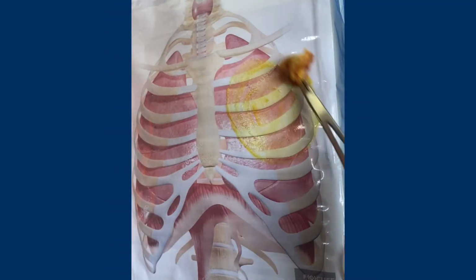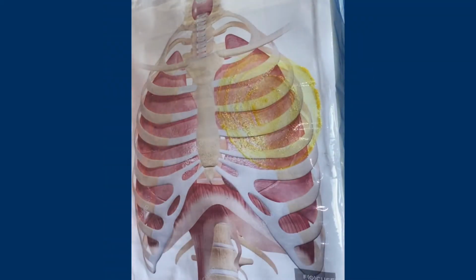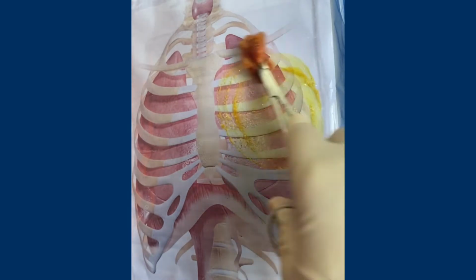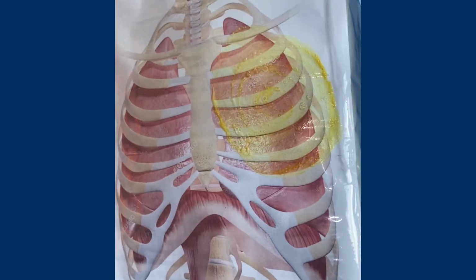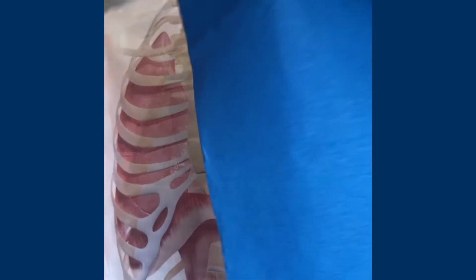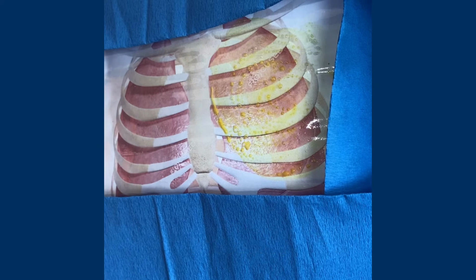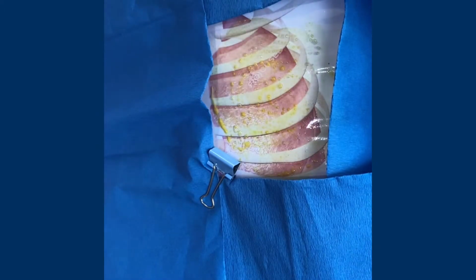Prep the skin with povidone iodine using forceps and cotton balls in a wider area in case there is a need to go further in the insertion. This should be done in an outward concentric motion. Drape the area with 4 towels and not with a single fenestrated sheet. Place the first towel on the surgeon's side, cephalad, caudad, and the side opposite that of the surgeon. Use towel clamps to secure the drapes.